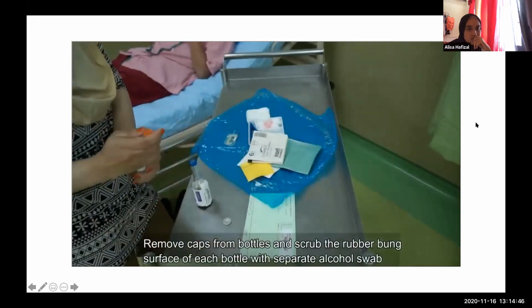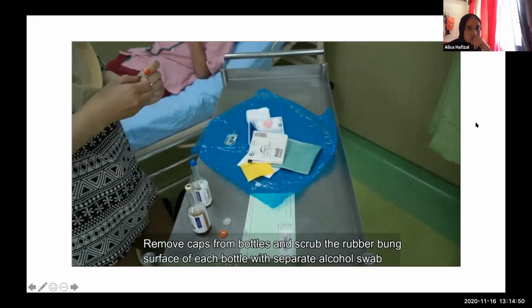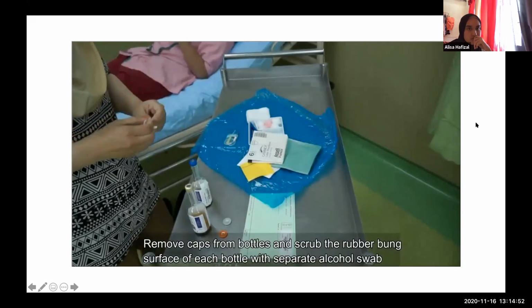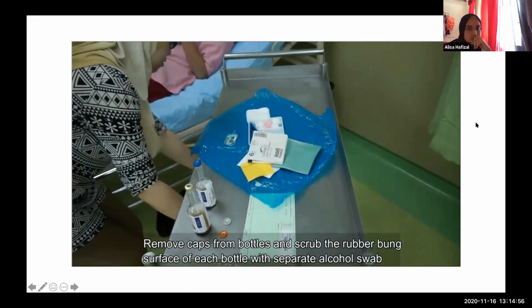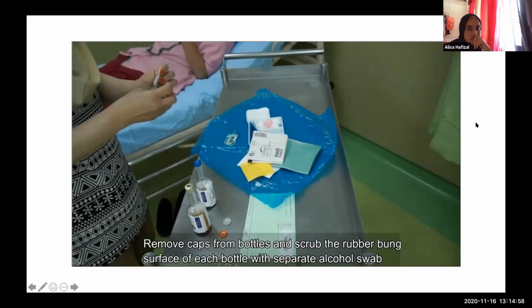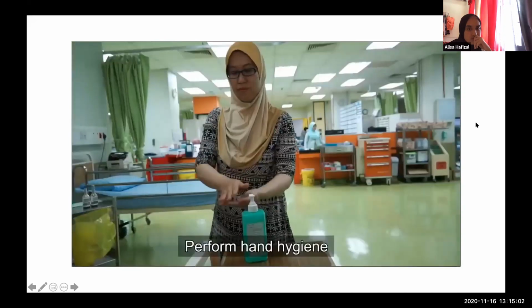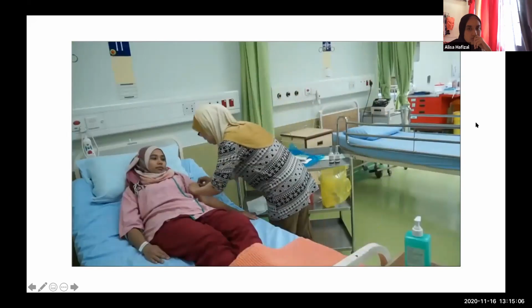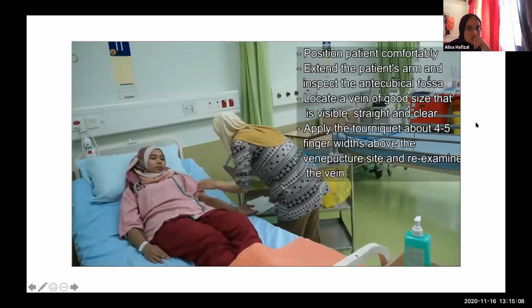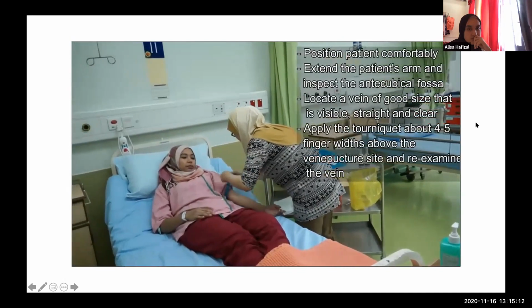Remove the caps of the culture bottles and rub the rubber tops of the bottles with a fresh alcohol swab to sterilize for 30 seconds. Use a separate alcohol swab for the two bottles. Perform hand hygiene. Apply tourniquet to the arm of the patient and identify a suitable site for venipuncture.